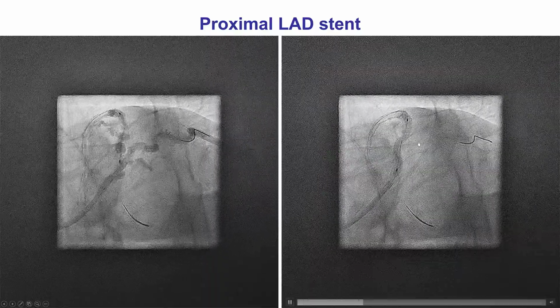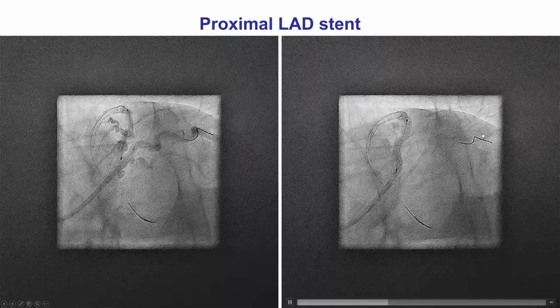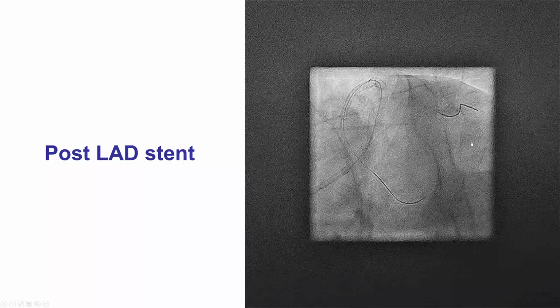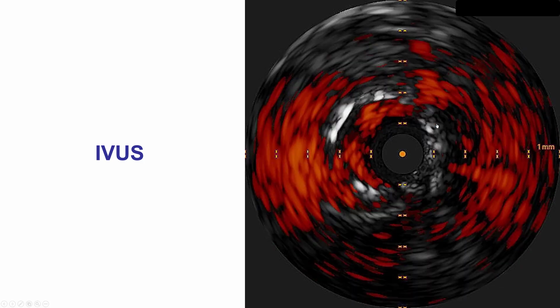And then we overlapped it more proximally, stenting all the way to the LAD ostium, having a wire into the ramus for protection. And this provided a nice result into the LAD without compromising flow into the large ramus branch.